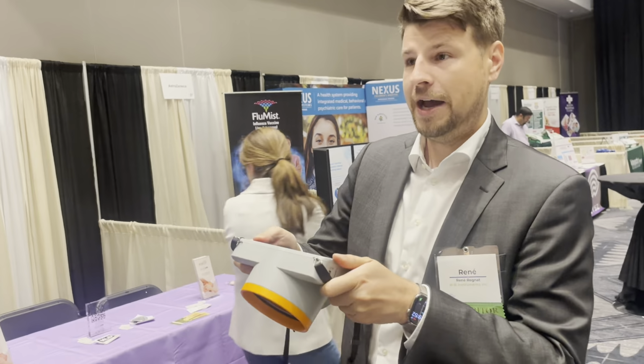Never measure top down because children tend to look like this, pupils covered. Never measure like this, you sit and the child stands, because children will look like this. If the child sits on the lap of a parent, don't let them sit like this, pupils covered. Long hair, out of the face. No hoodies, no caps. Make sure the eyes are visible, eyes are open.